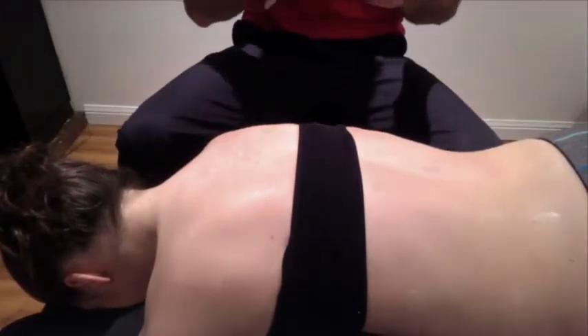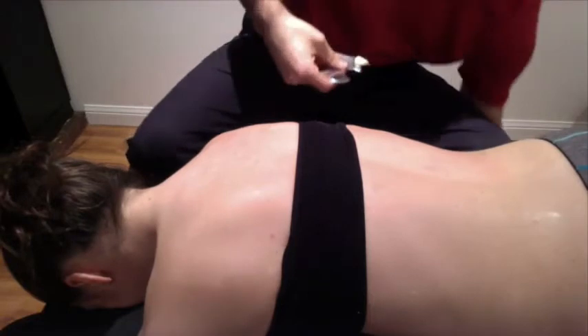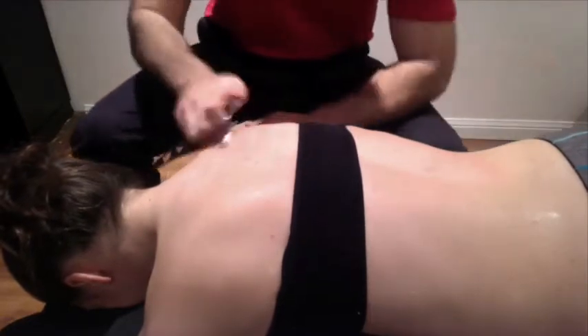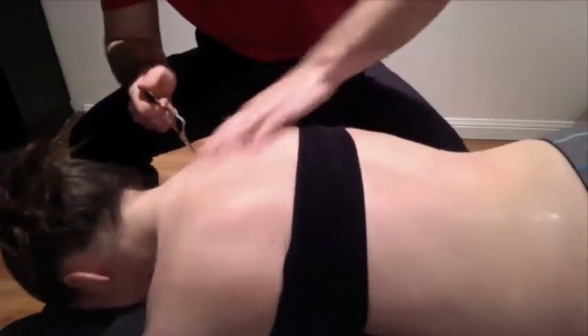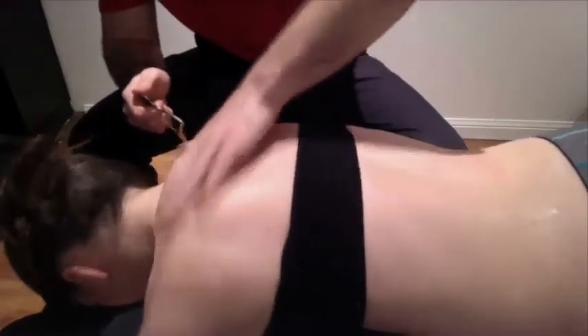Alright, so now we're going to continue treating into the upper T-spine, the traps, levator, all that stuff. Like in the previous video, I said we're having a little bit more issues up top than we were down low. So we're going to go and find out exactly where those are coming from.